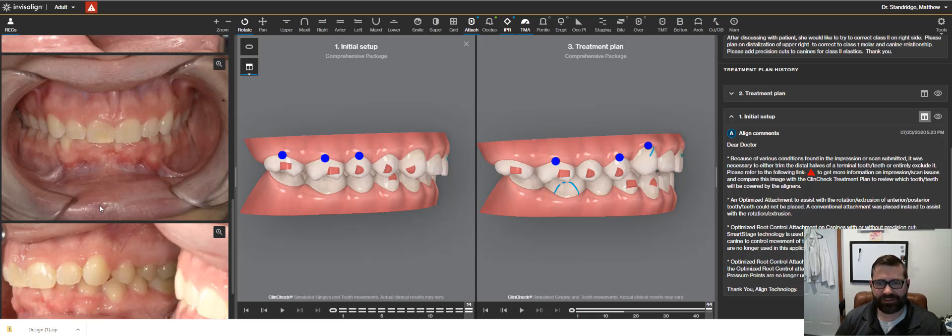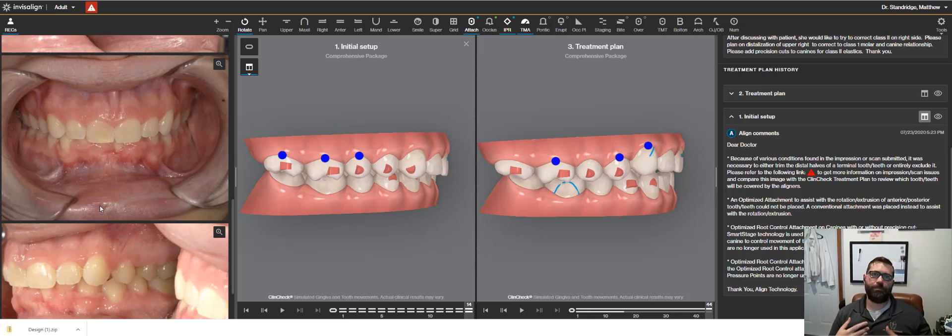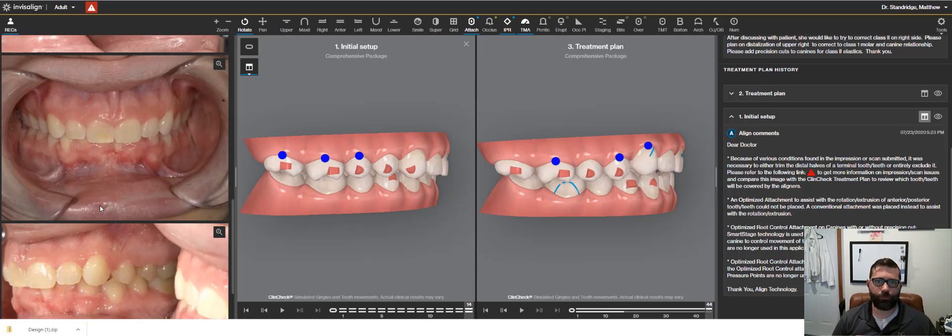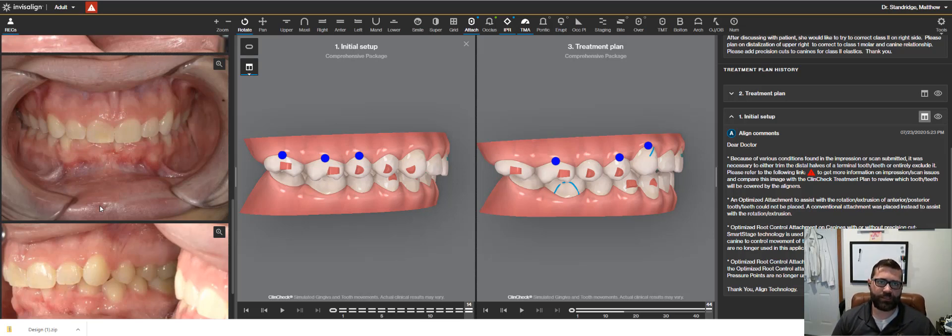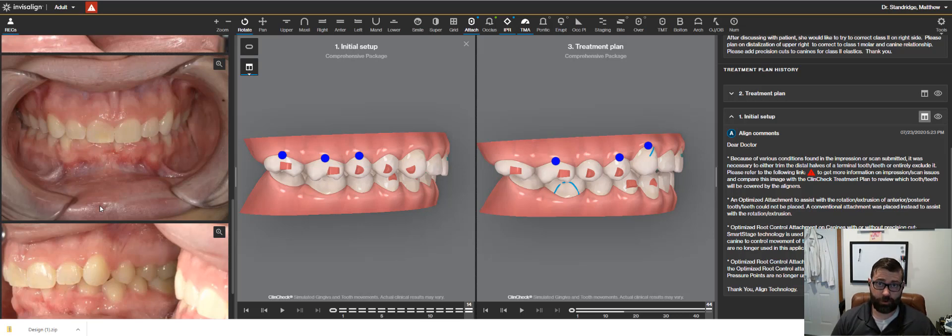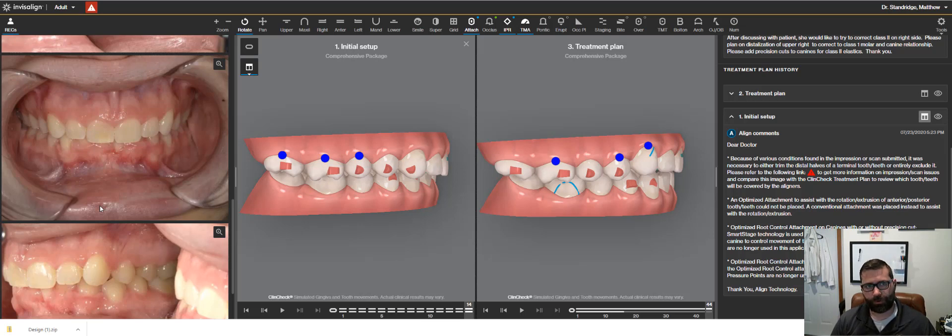Hey everyone, Matt Standridge here. I want to do a little video going through a good case here, a good Invisalign case, kind of discussing things I look for on our clinic checks and when we're doing a pre-op workup.